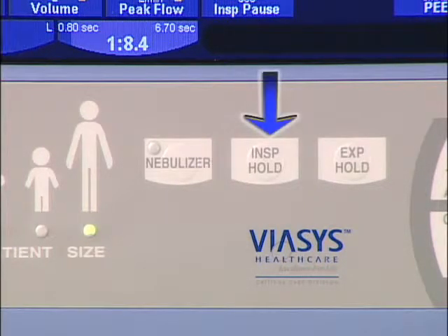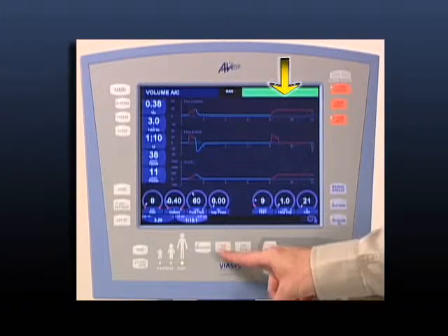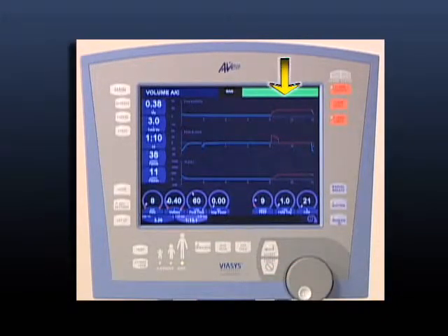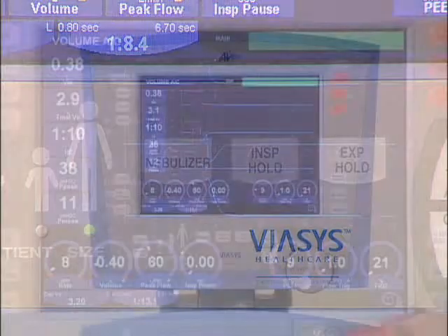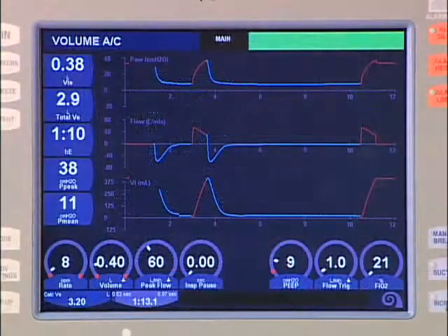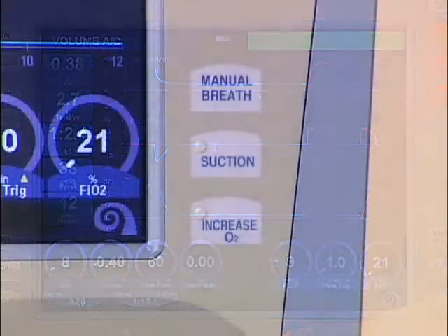The inspiratory hold button is used to obtain static measurements such as plateau pressure and static compliance. When pressed, once the mandatory breath has been delivered, the patient will not be allowed to exhale until either the button is released or a maximum time of 3 seconds has elapsed. Pressing the expiratory hold button will not allow the patient to inspire or exhale at the next breath interval for a maximum of 20 seconds in adults and 3 seconds in neonates. Simply release the button to return the patient to the prescribed ventilation.